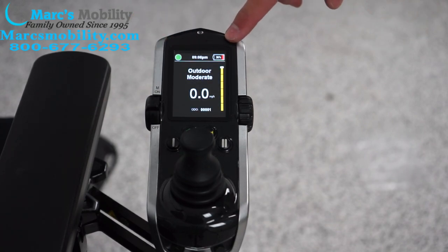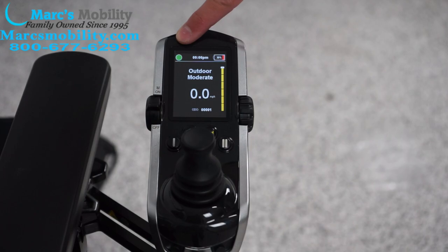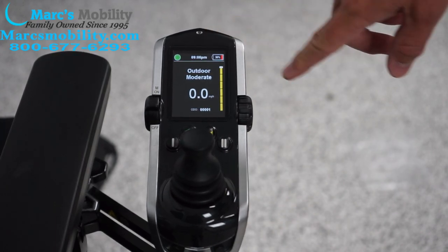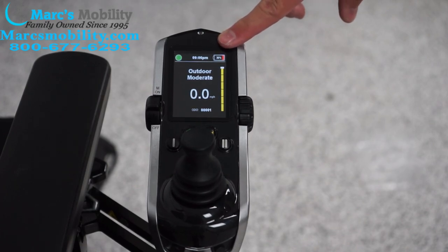There are a couple of different things we can show you on this joystick. You have a green circle, which means you're able to drive and you're no longer in a position that is not safe to drive. Over here you can tell we need to charge our batteries — it actually shows the percentage at 30% with a little red line showing that we are at the lower end of charge.